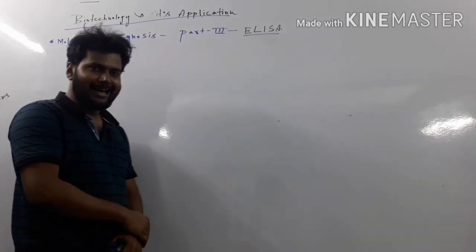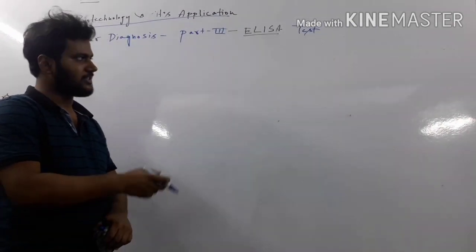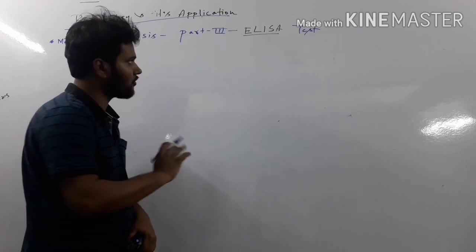In this part, we will discuss the ELISA test or ELISA technology. It is basically one test which detects different types of antigens present in the serum or any other fluid. So first let us write what ELISA stands for, okay?